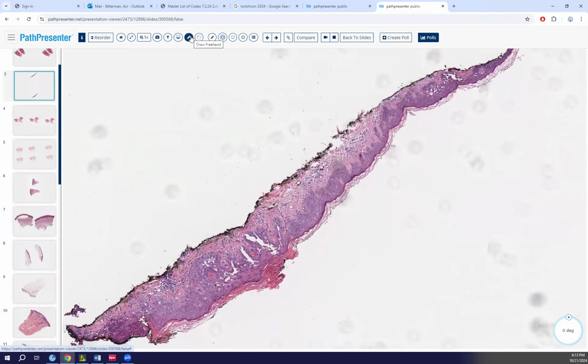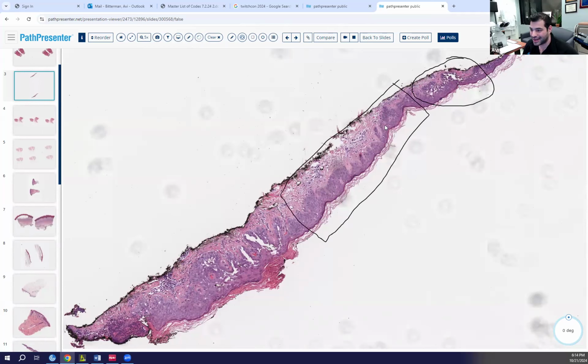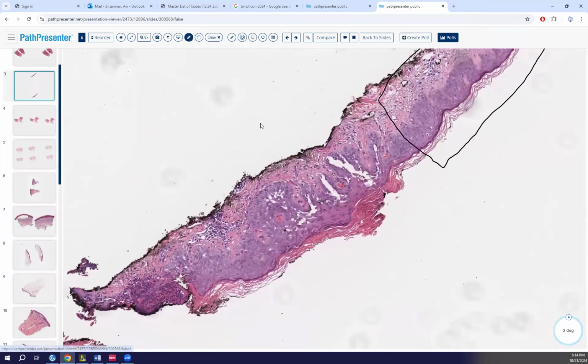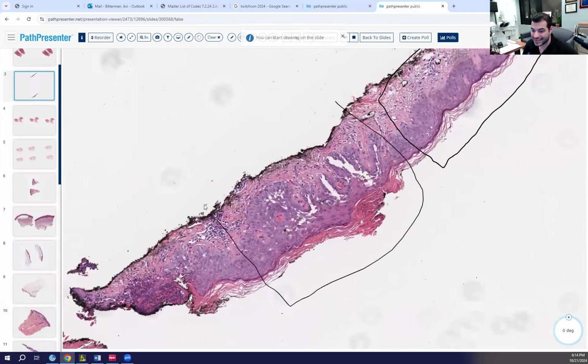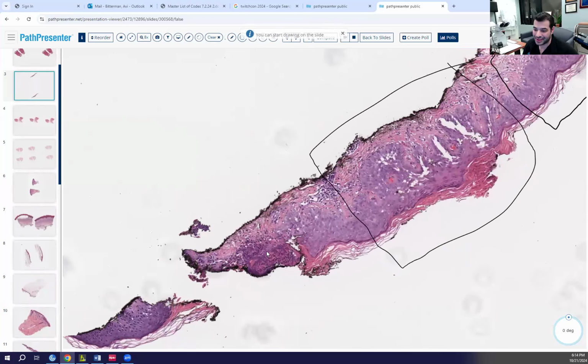Versus Grover's. In Darier you get clefting, but it's more extensive. Yeah, acantholysis. It's more broad. Look at the extent here. It starts here, and this is all good. Is there anything wrong with this? Not really. And then here's the extent of your next lesion. That's it. Maybe you're getting into something here. You can't really tell. It's a bit ulcerated and potentially impetiginized.